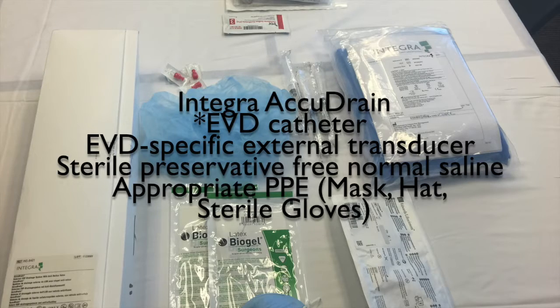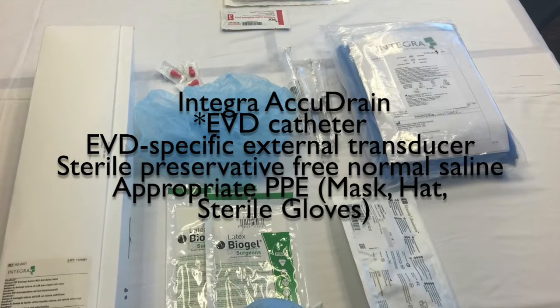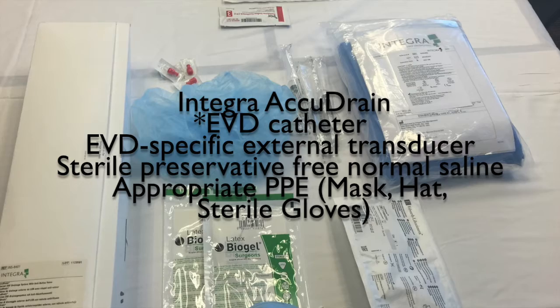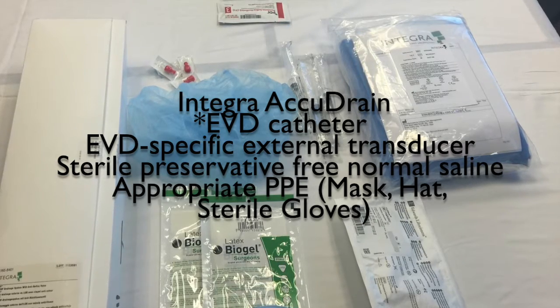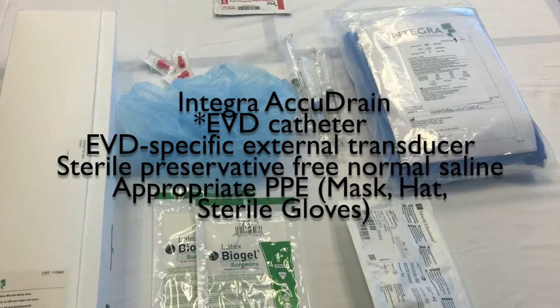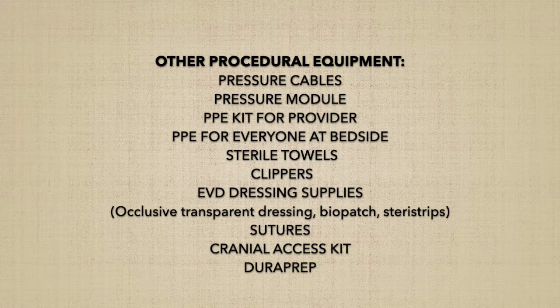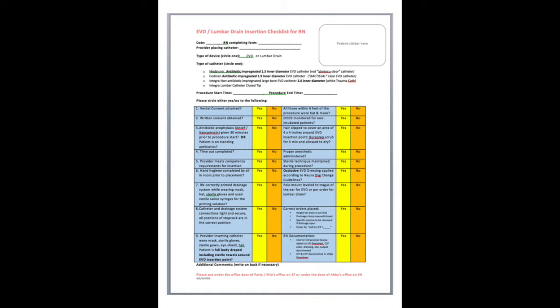For supplies, you will need an Integra AccuDrain, an appropriate EVD catheter as requested by your provider, an EVD-specific external transducer that does not have a manual flush device attached, sterile preservative-free non-bacteriostatic normal saline flushes, appropriate PPE including hat, mask, and sterile gloves, pressure cables, a pressure module, PPE kit for your provider and everyone at the bedside, sterile towels, clippers, transparent dressing, sutures, cranial access kit, and Betadine or Dura-Prep.